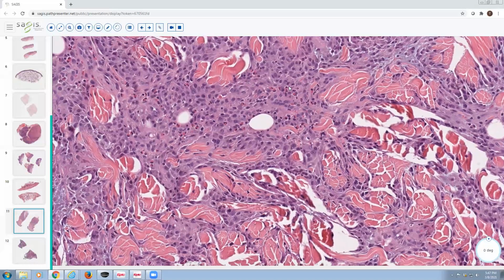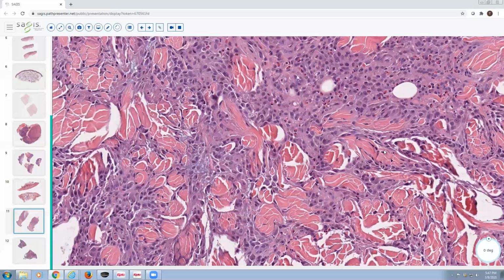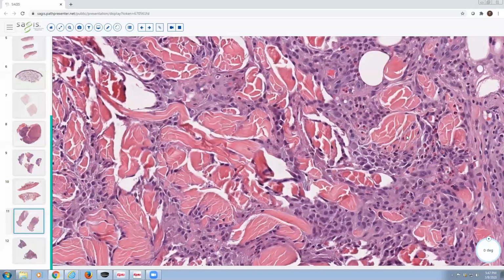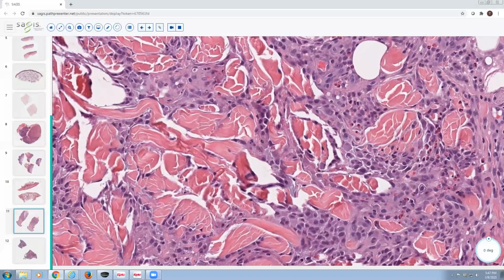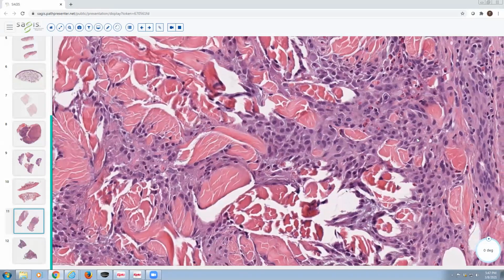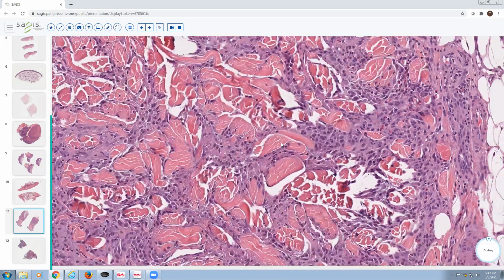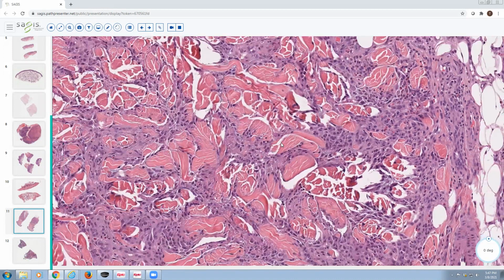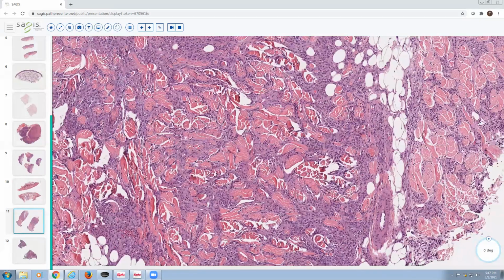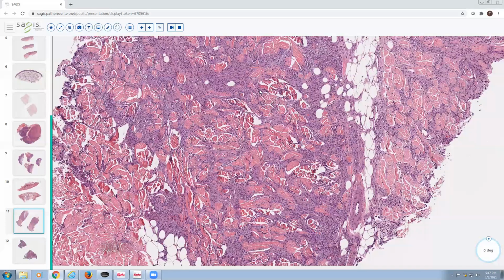So these are histiocytes. And sometimes you can find multinucleated cells that really help you confirm that it is a histiocytic infiltrate. So that can be helpful to find multinucleated cells, but not required. When histiocytes are the predominant inflammatory cell type, we call that granulomatous. So if you wanted to define the word granulomatous in a very simple sentence, you would just say histiocytes predominate.